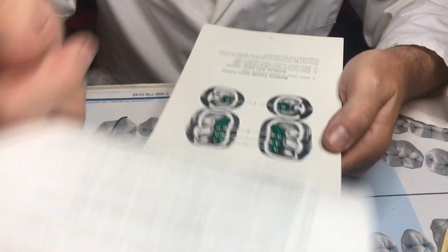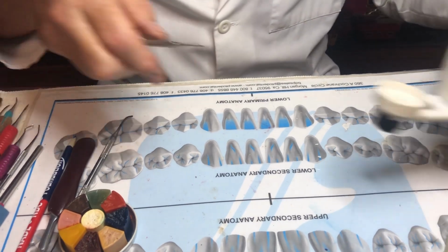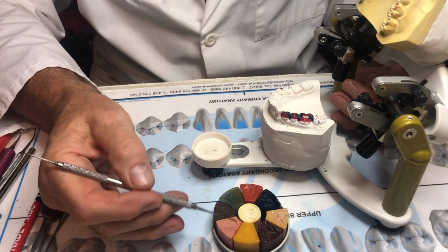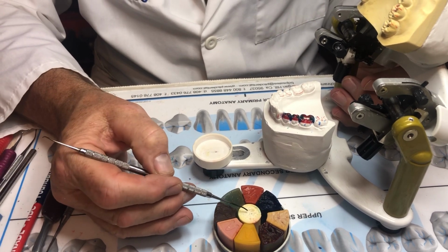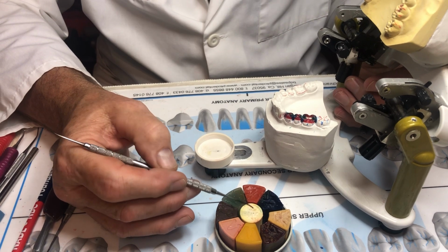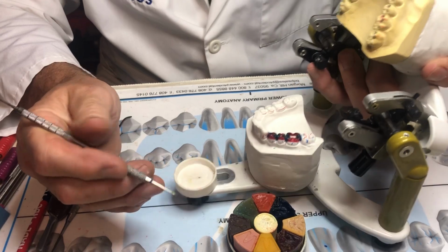So let me go back, and in no particular order, we'll start. Let's jump over to another color. I think you all have multi-colors, and I think you have a large octagon block of wax that you got in first semester, which is similar to what I have here. So I just want to do it in different colors so you can see where we are.